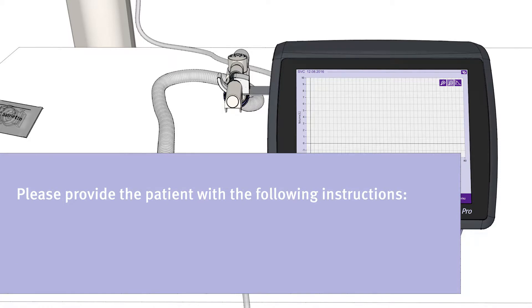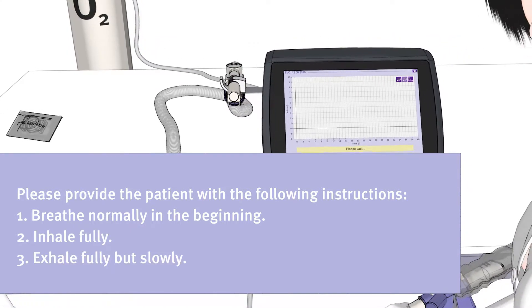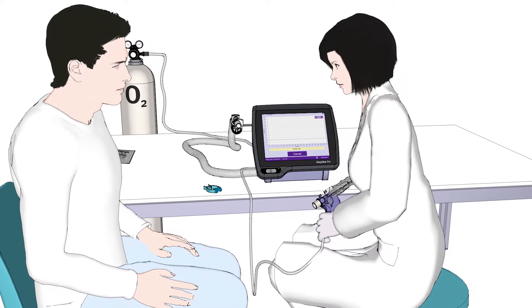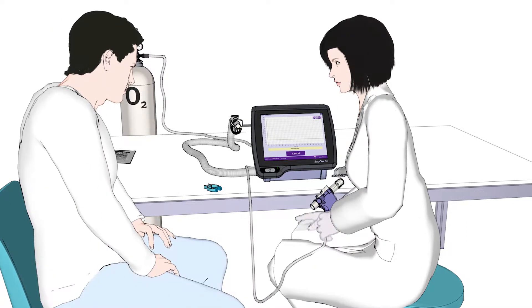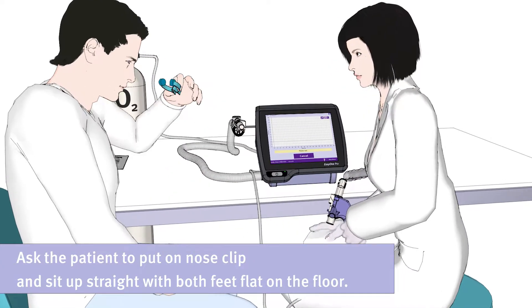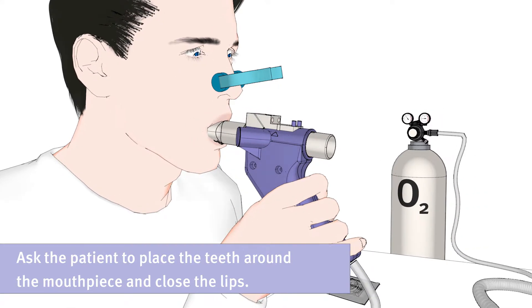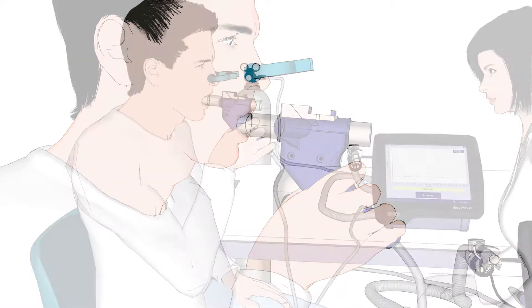Please instruct the patient to breathe normally in the beginning, then fully inhale, and then exhale fully but slowly. Please remove the plastic wrapped around the mouthpiece. Ask the patient to put on the nose clip and sit up straight, with both feet flat on the floor. Ask the patient to place their teeth around the mouthpiece and close their lips. Please ask the patient not to bite or block the spirette with his tongue or teeth and to avoid leaks.